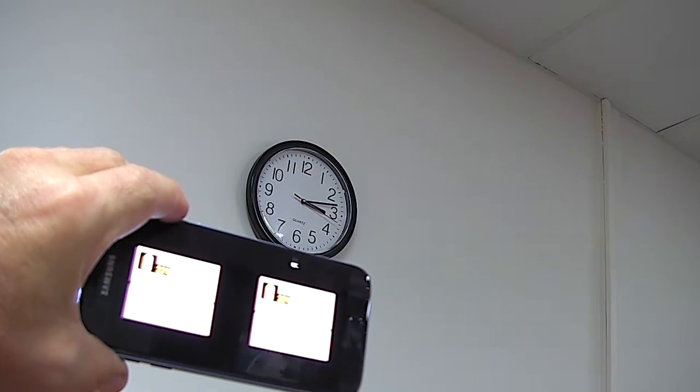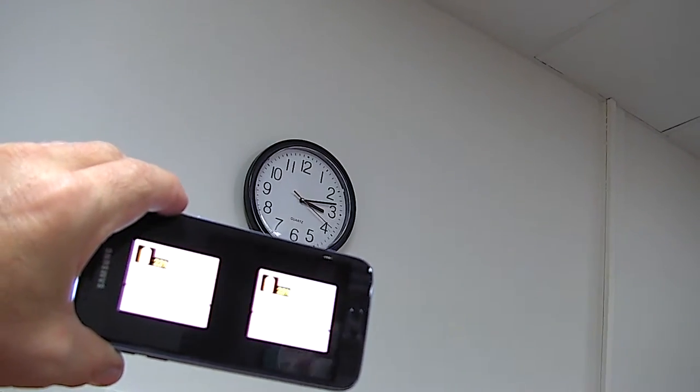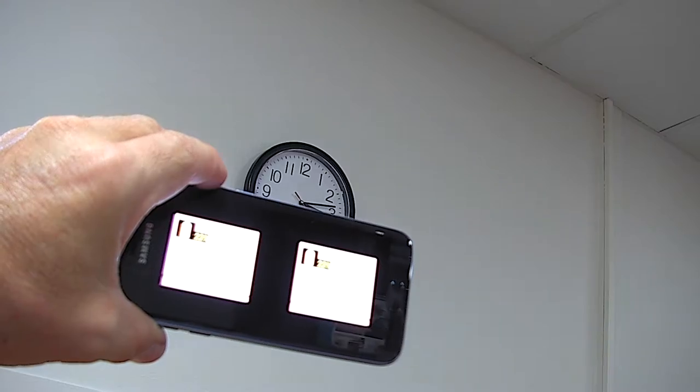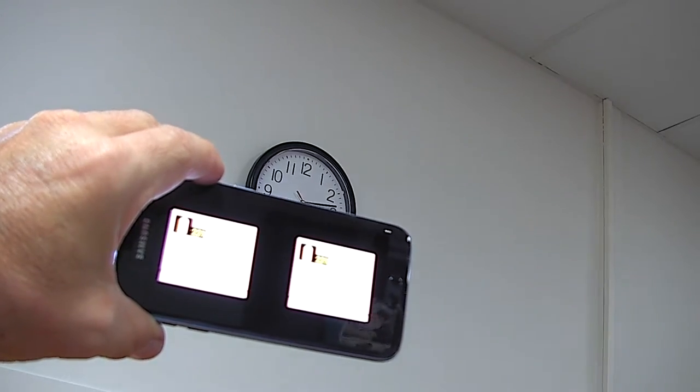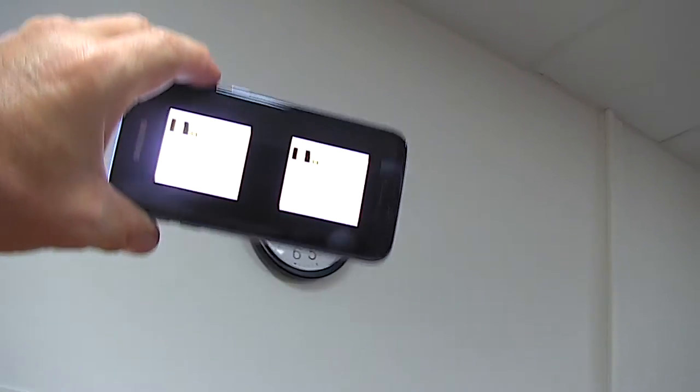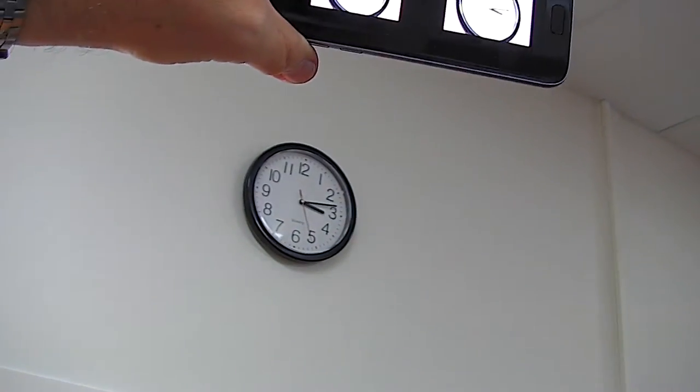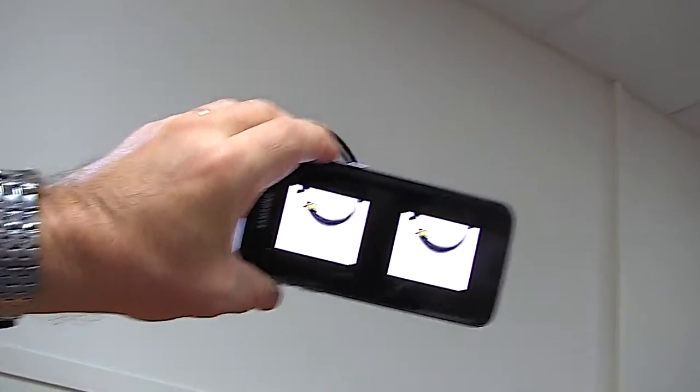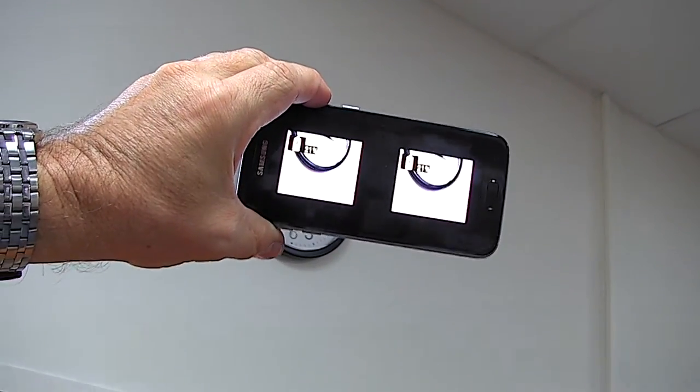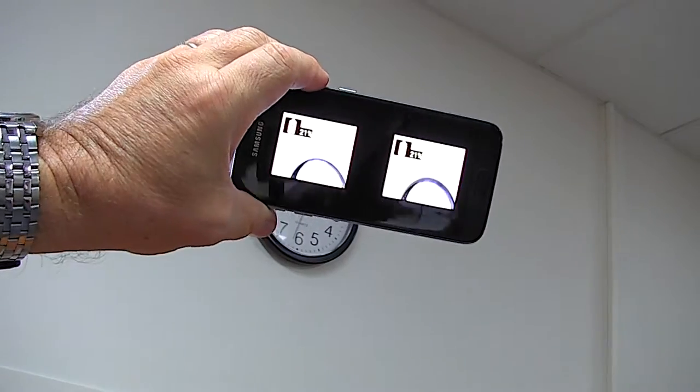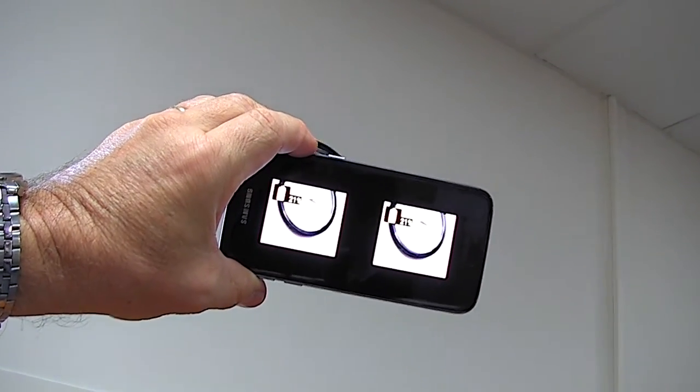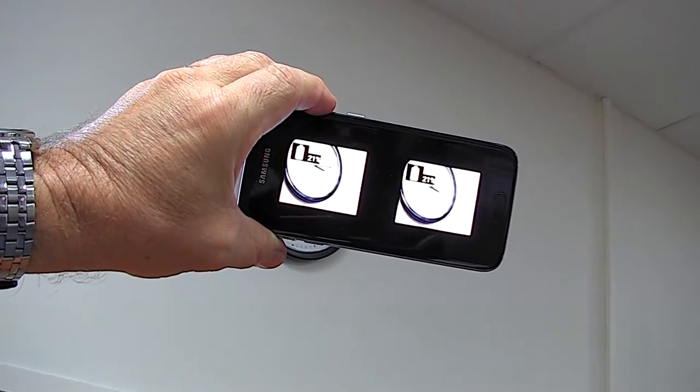This is what's being seen from the Samsung phone that's mounted in the IrisVision headset. Here we can see two images of the clock, one for each eye.